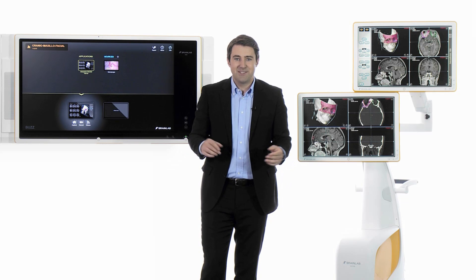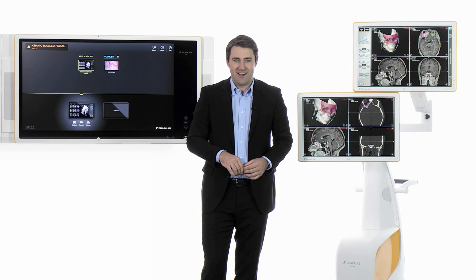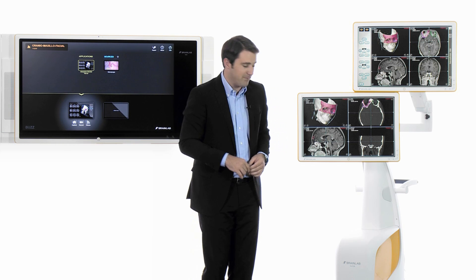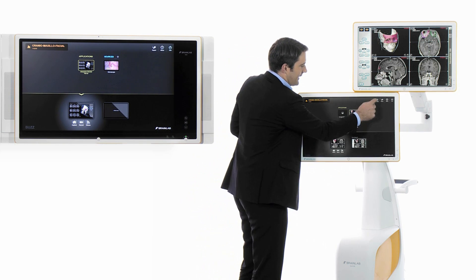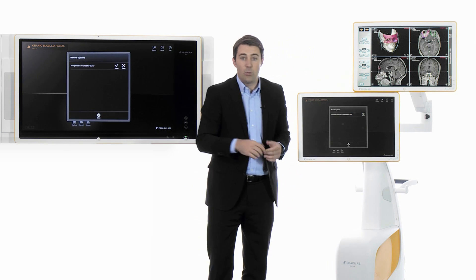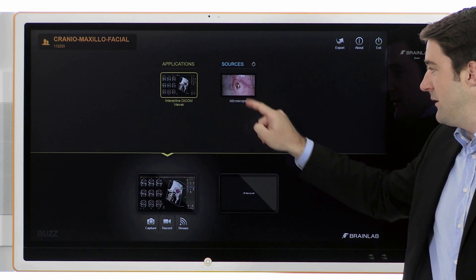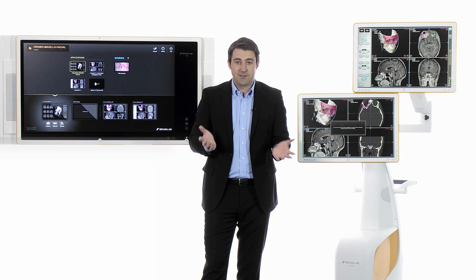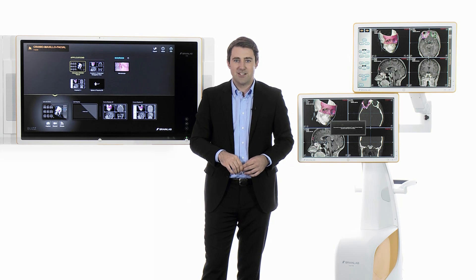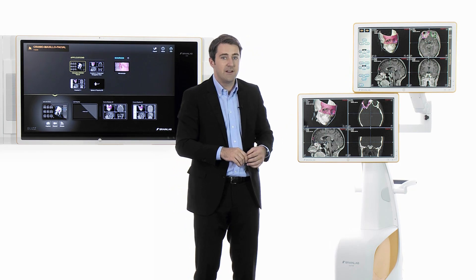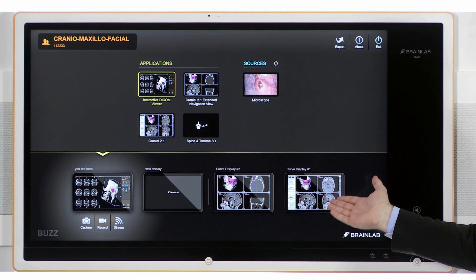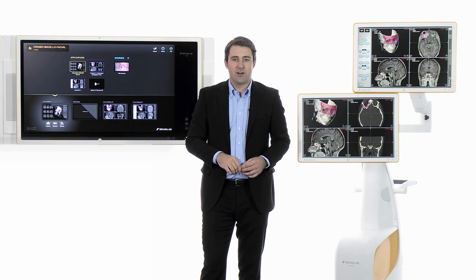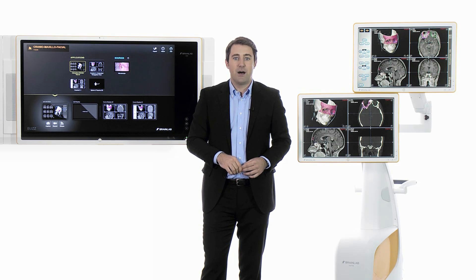Buzz seamlessly integrates with other BrainLab devices, like Curve, our information-guided surgical navigation platform. From Curve, I can connect to Buzz. Once I accept the connection, Buzz and Curve function as one virtual system. As a result, all additional applications, like navigation software from Curve, naturally appear on Buzz. And conversely, the touchscreens of Curve operate as additional Buzz displays.